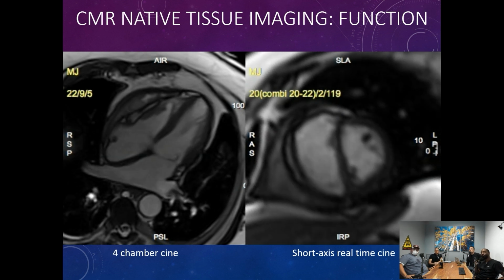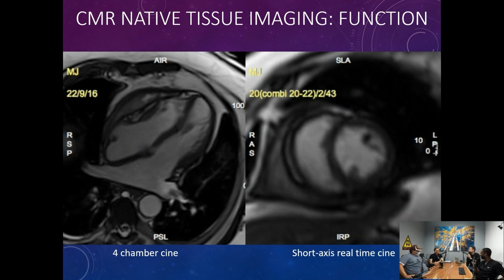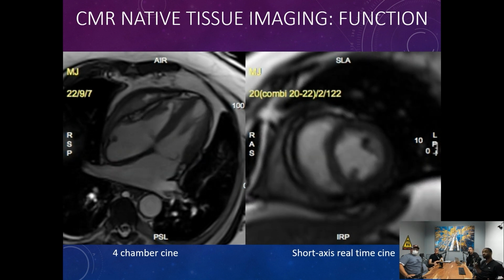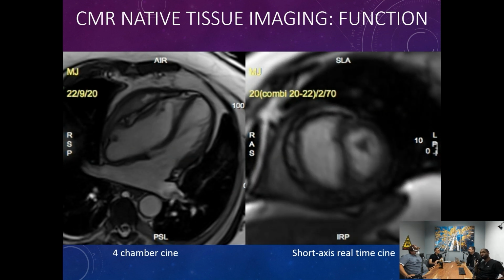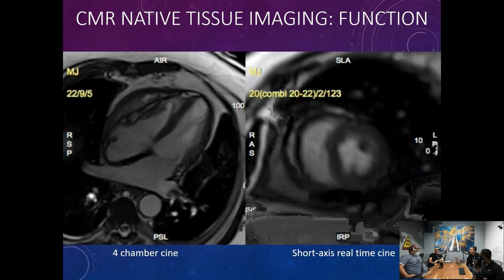So just to show that gadolinium is useful, but we can get a lot of information even without the injection of gadolinium. You know, since you got that free breathing cine up, I did have a question for you. I've worked with you, and you've told me to make sure to include a free breathing cine if a patient has history of pleural effusion. Okay. What's the reason for that?